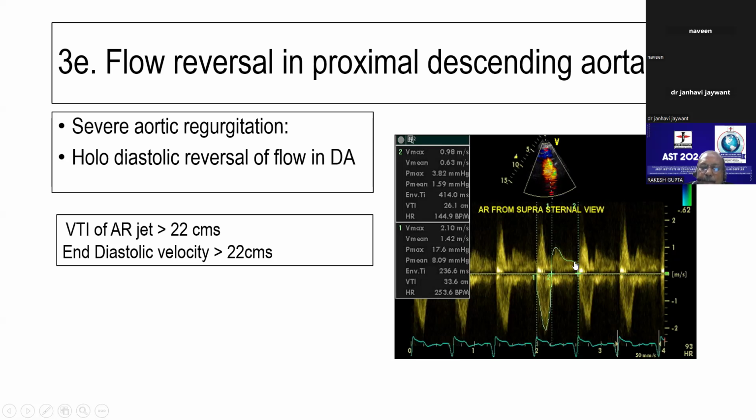So there are two components in that reversal. One is VTI and another is end diastolic. There is no end diastolic component over here. This is the end diastolic component over here. Don't look at this graph. Don't look at these values. Look at the values over here.